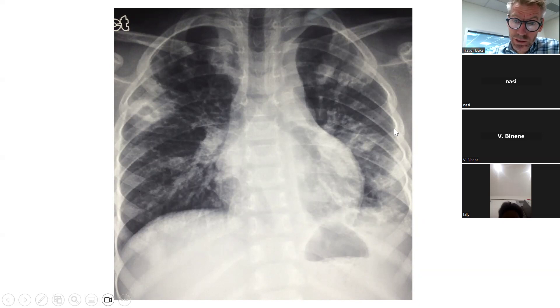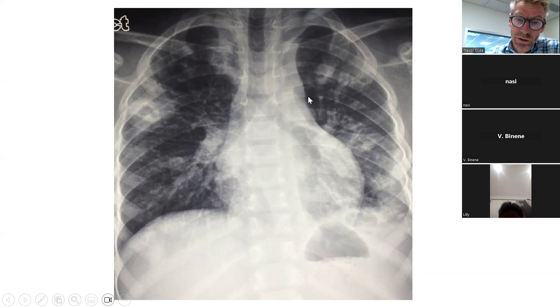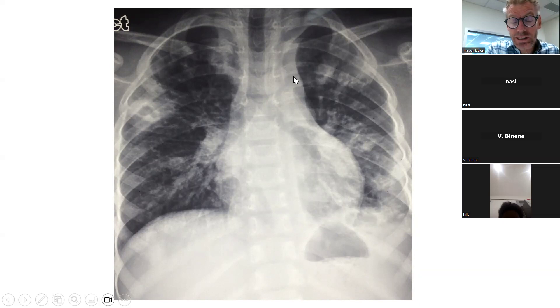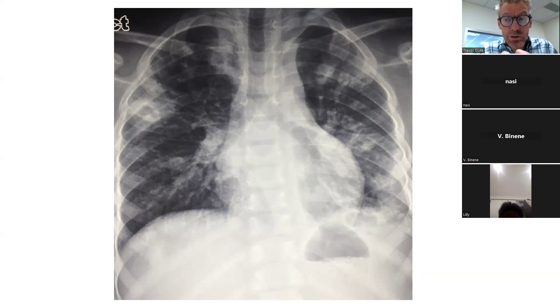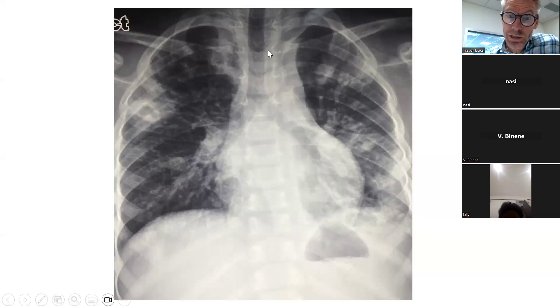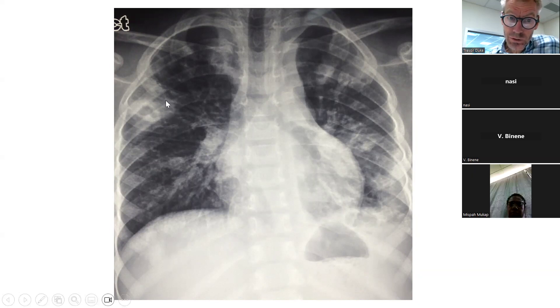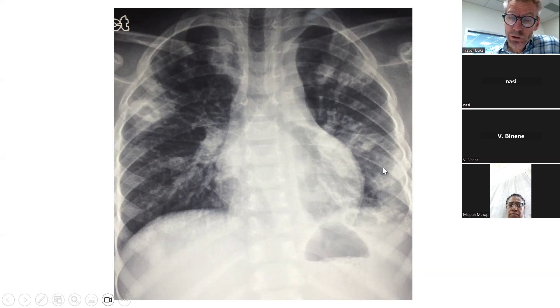A poor inspiratory film doesn't necessarily mean the child hasn't taken a big breath — it may mean there's collapse, low lung volumes, or disease. It's useful to categorize diseases by lung volume: small lung volume diseases include pneumonia and atelectasis, where lung tissue is collapsed. This X-ray shows patchy opacity throughout both lung fields — this is bronchopneumonia — but there's something else visible too.